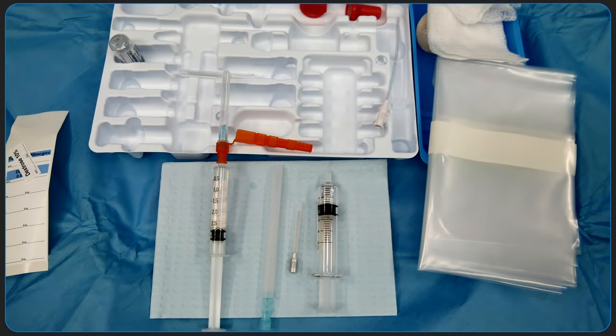Finally, it's helpful to arrange the components of the kit in a clear spot for easy access. And that is all you need to set up your spinal anesthetic kit.